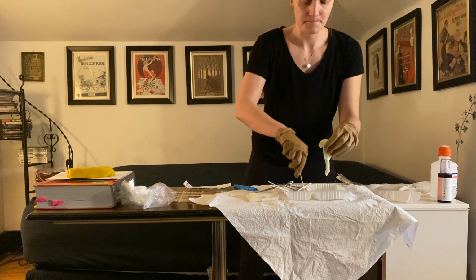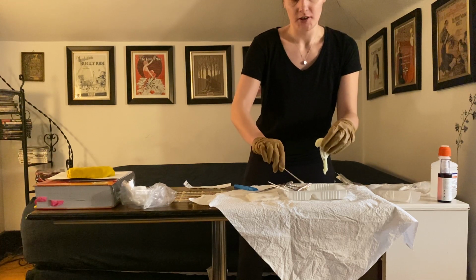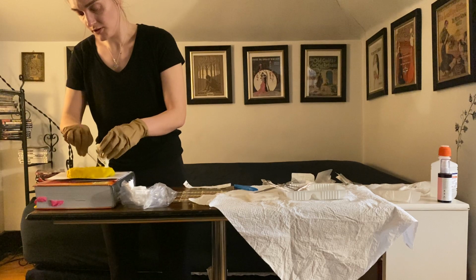Okay. So I'm going to be packing. I don't want to pack too tightly, and I want to make sure I'm not touching the peri wound with the Curlex because I don't want to bring any new contaminants into the wound bed. So I'm not packing too tightly.